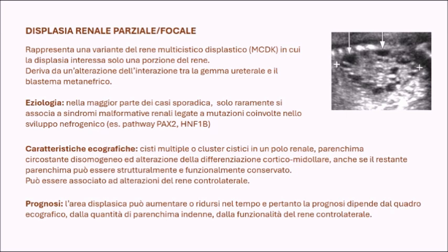The contralateral kidney is also carefully and very thoroughly evaluated, as it may sometimes be affected by the exact same abnormality. In this particular case, the prognosis is quite variable. It depends largely on the total extent of the dysplastic area, which may increase or decrease over time, as well as on the amount of unaffected parenchyma and the function of the contralateral kidney.